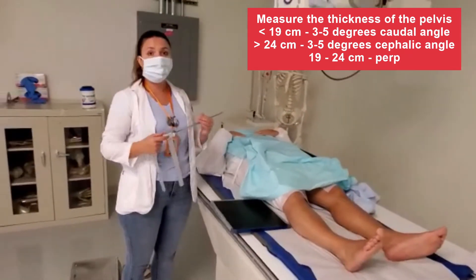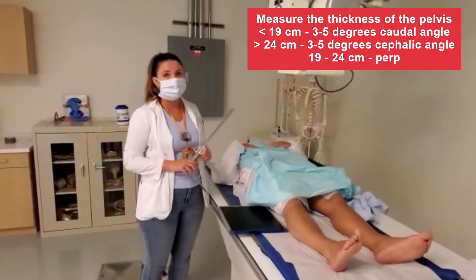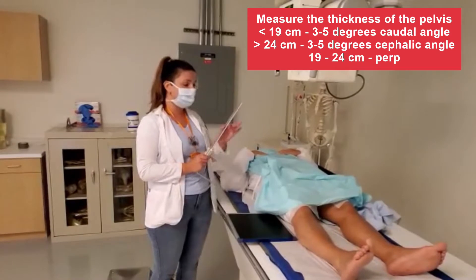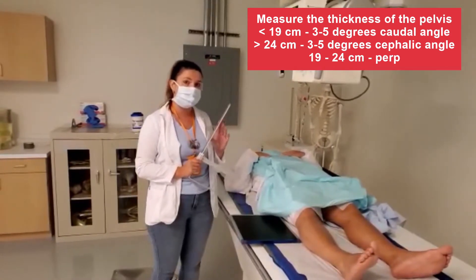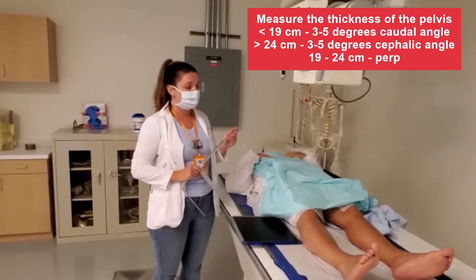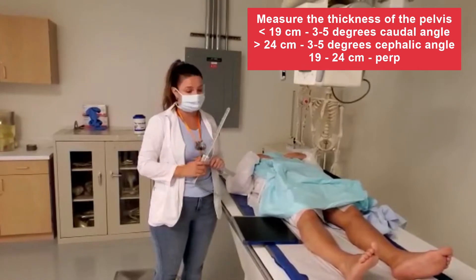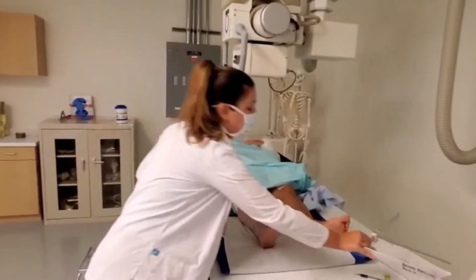When the pelvis is thin, which is less than 19 cm, we are going to angle the tube 3 to 5 degrees caudal. If the distance was more than 24 cm, we will be angling cephalic 3 to 5 degrees. And when it is between 19 to 24, we keep it straight perpendicular. So in our case, it will be 3 to 5 degrees caudal.